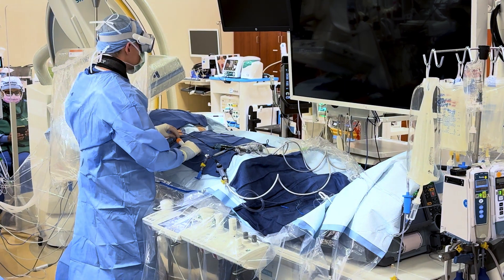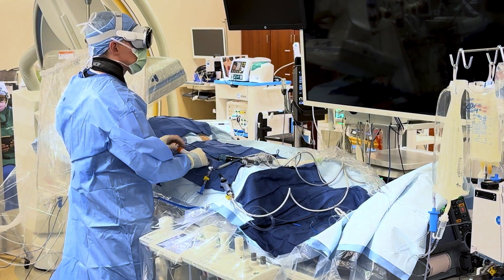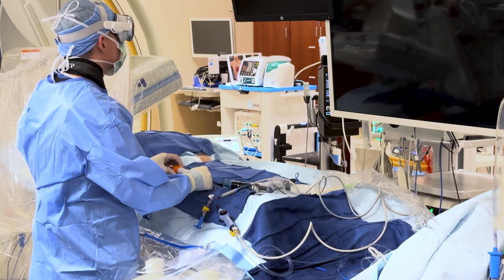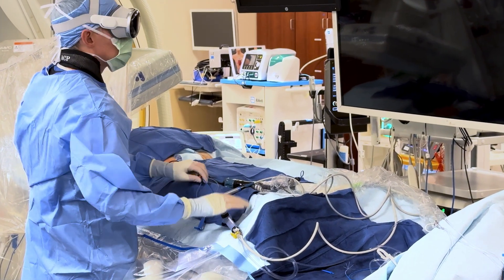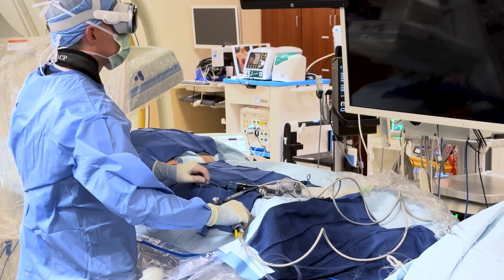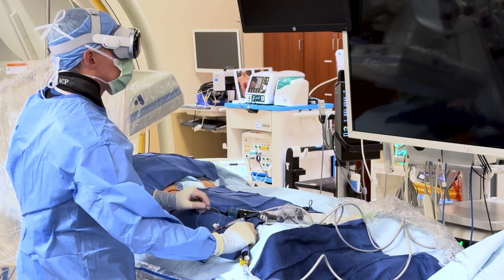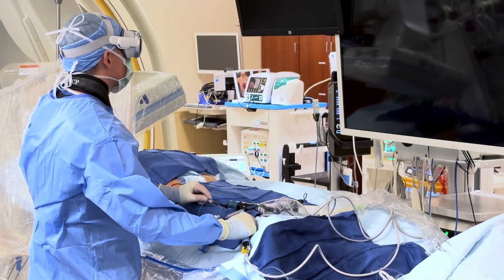We were then able to do a start-to-finish atrial fibrillation ablation — from accessing the patient's femoral veins, to performing the ablation, to closing the device — all while wearing an Apple Vision Pro and consuming all of that data and information through an augmented reality screen that wasn't visible to other people in the room.